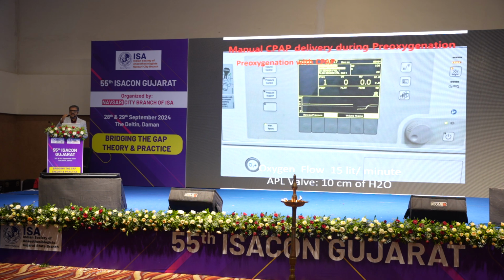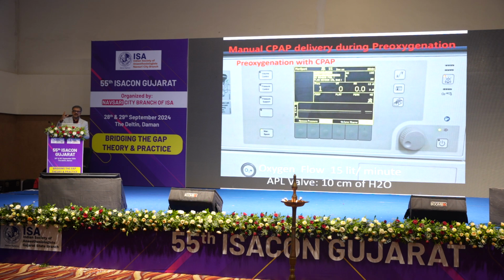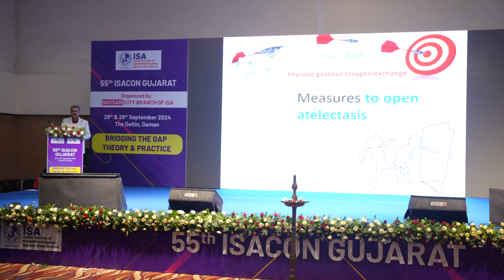And if you have a CPAP mode on your machine, you can deliver CPAP by optimal mask fitting. So now coming to this, low pressure is required to prevent atelectasis formation. 8 to 10 pressure is required to prevent atelectasis formation.